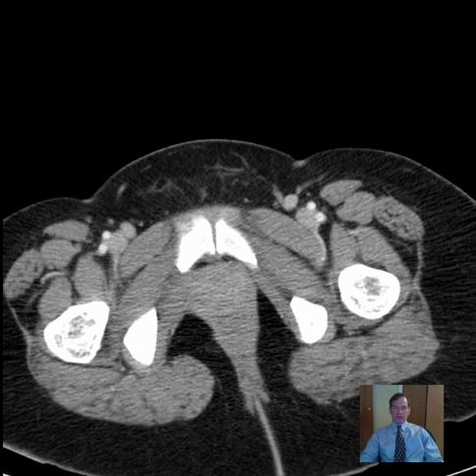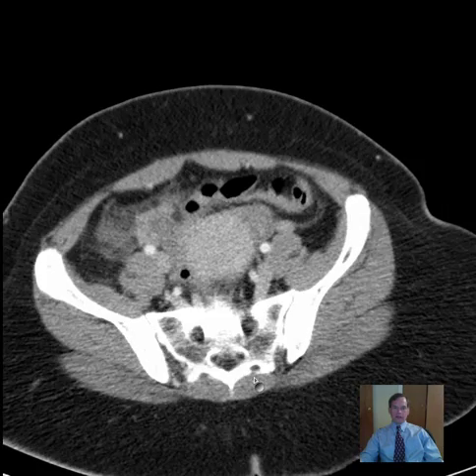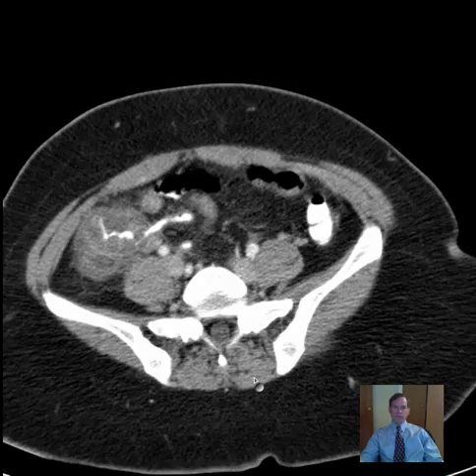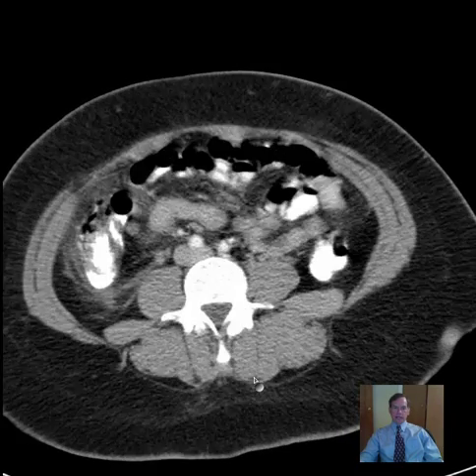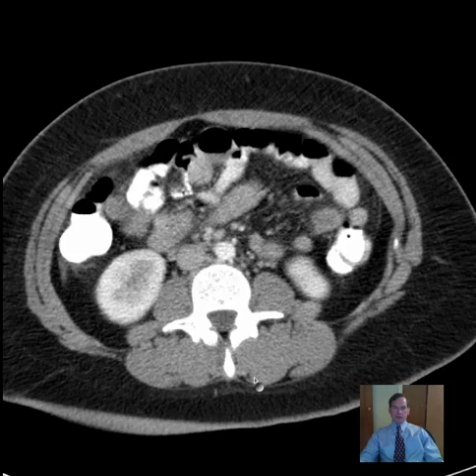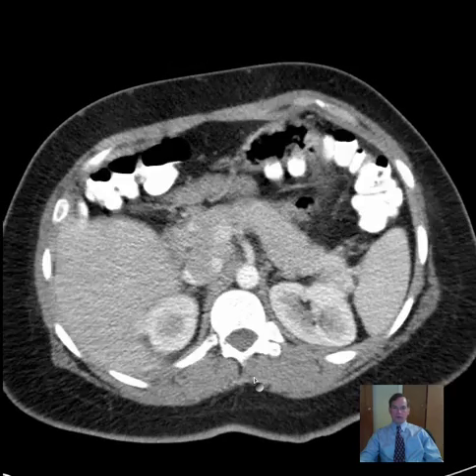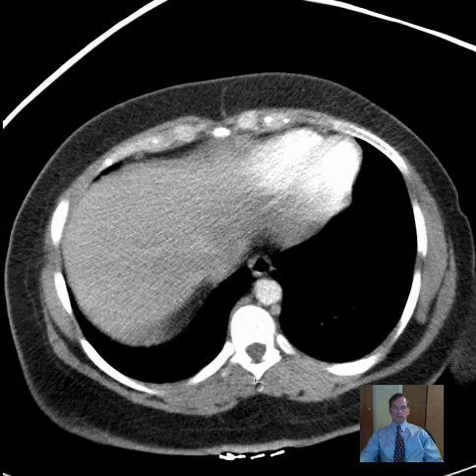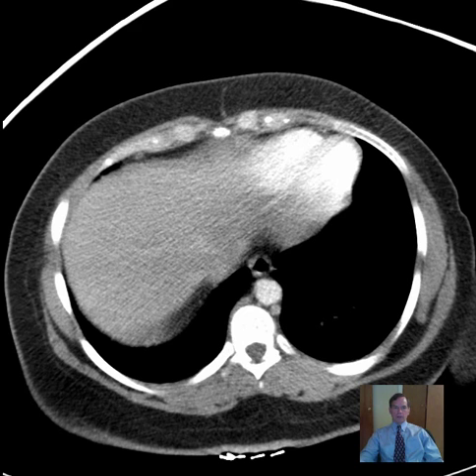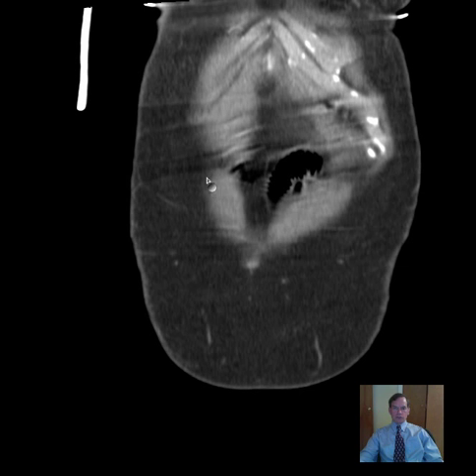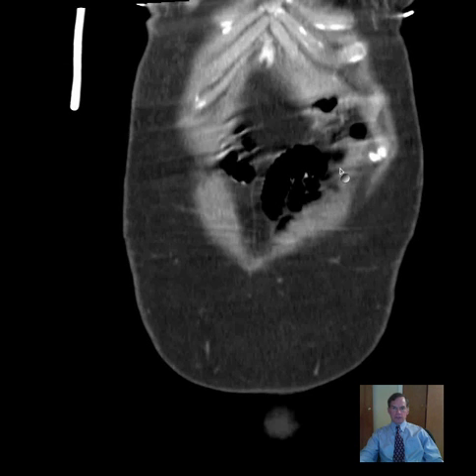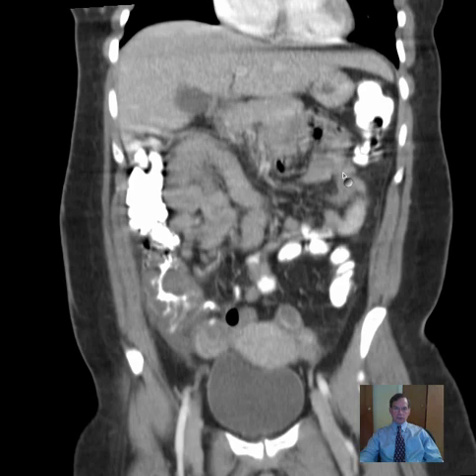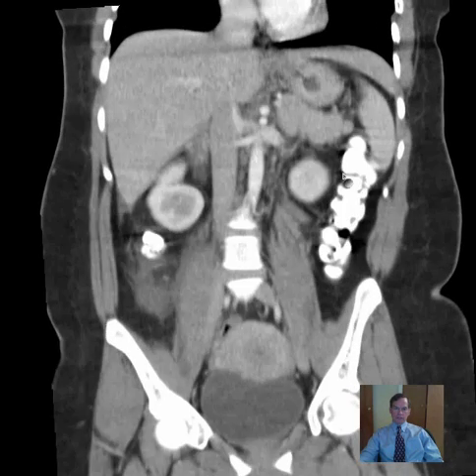Hello there. This is Dr. Mintz. This is a patient who presented with right lower quadrant pain and fever. I'll scroll through the axial images here so you can have an overview of the case, and then we'll switch to coronal images again for an overview of the case.